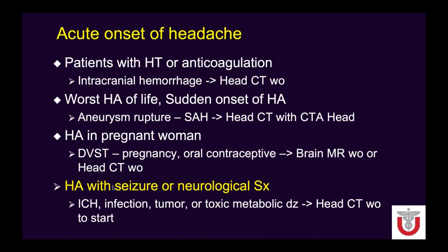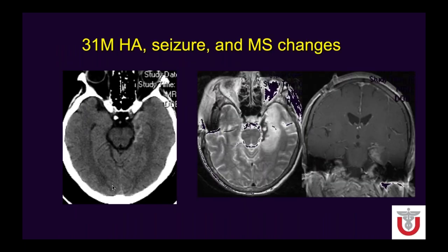The last acute category is headache with seizure or neurological symptoms — looking for infection, tumor, or toxic/metabolic disease. Non-contrast head CT is a good place to start. Example: a patient with headache, seizure, and mental status change. MRI shows high signal along the mesial temporal lobe with a blood product on T2 and adjacent vasogenic edema. Post-contrast shows enhancement of the mesial temporal lobe — this is herpes encephalitis. Mesial temporal lobe involvement with hemorrhagic enhancement is the classic appearance for herpes encephalitis.